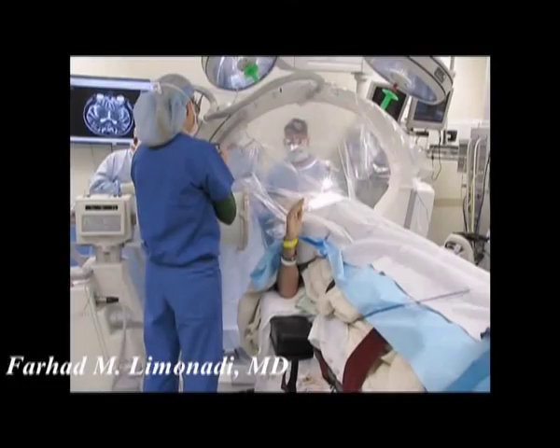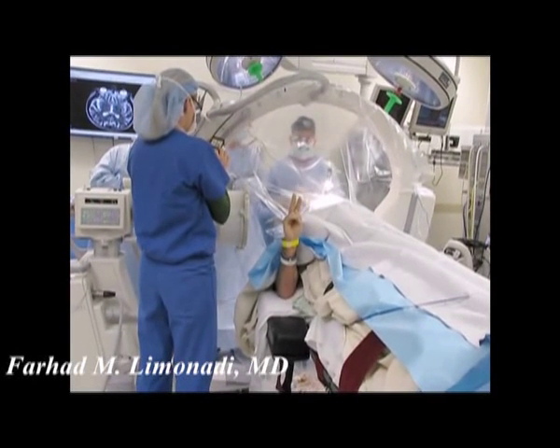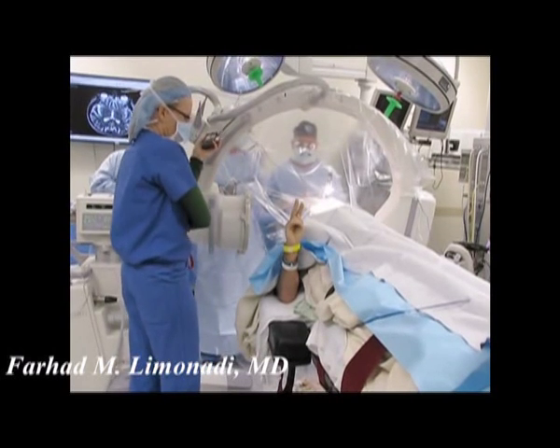Let's wait and see what happens. Can you hold up two fingers? All right. Good. So this is the lesional effect — it's just because we put the electrode in the target.